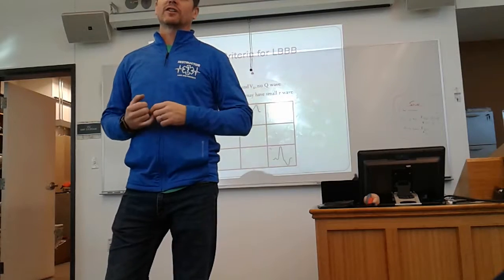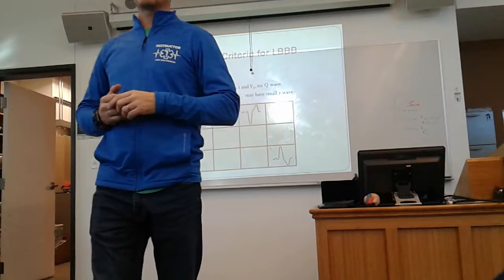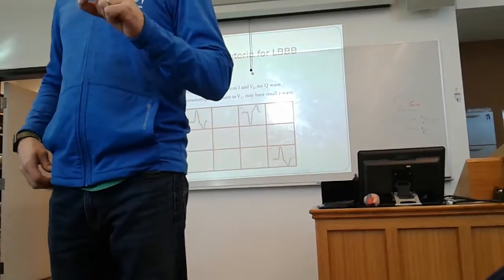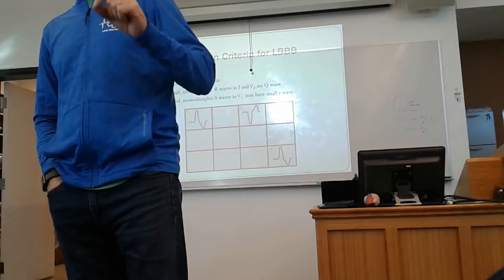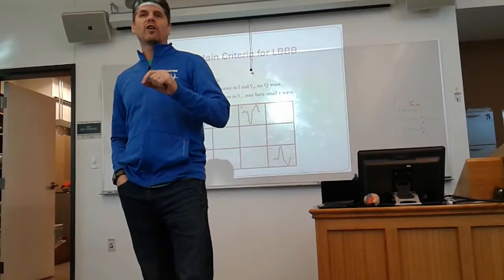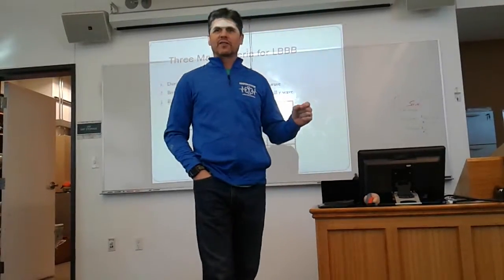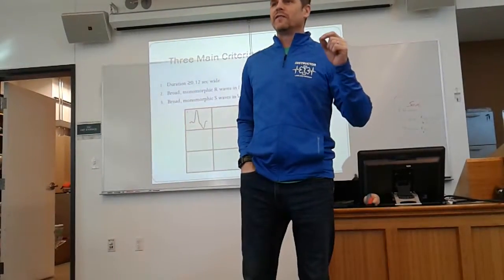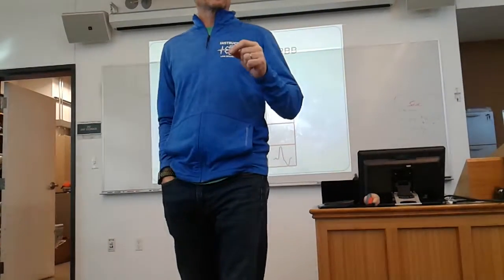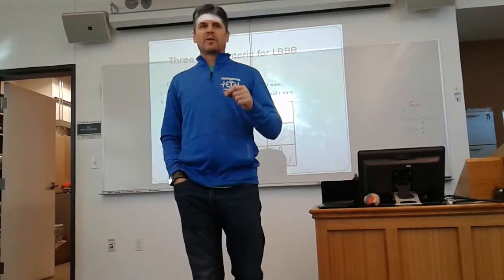You might have called it a ventricular rhythm, right? Because you really have a hard time seeing P waves in aVL right now. This is one of the benefits of a 12 lead. You might have called that an idioventricular rhythm or an accelerated idioventricular rhythm, and that would have been very incorrect, because this person definitely has a supraventricular rhythm, with this bundle branch block.